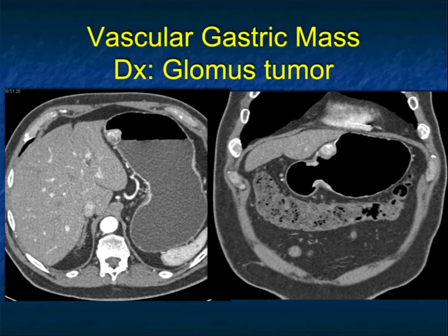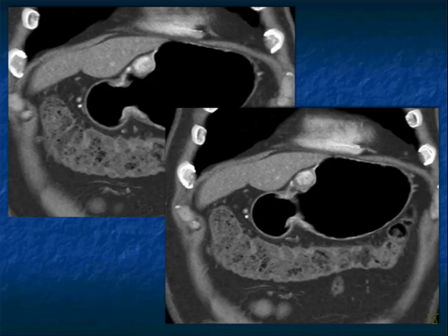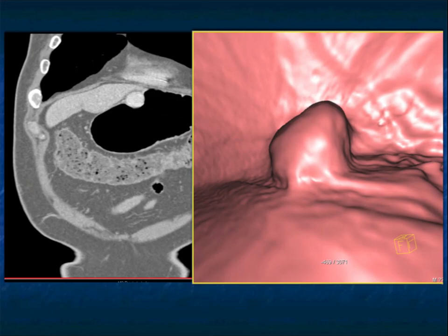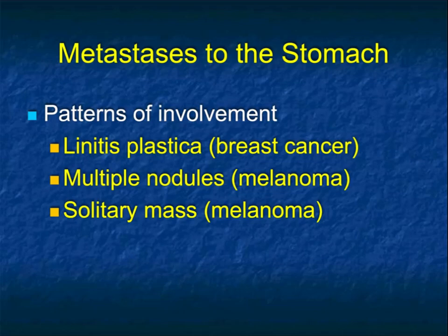There are other vascular tumors. Here's a vascular lesion in the stomach which could be a carcinoid tumor or metastatic renal cell — but this was a glomus tumor. Glomus tumors are rare but they're vascular, and here was a nice endoluminal view of that. Metastases to the stomach can present as polypoid lesions — that's uncommon — but metastases are very important.